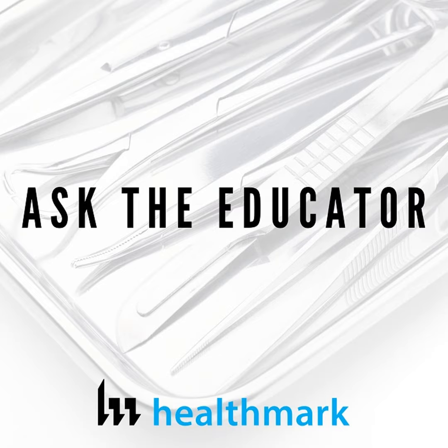So at any rate, I'm just going to add one quick thing too, because I think this is an important note. When you look at SPD and production, there's not one manufacturing plant in the world that allows one person to produce the product and not have somebody else check it before they put it on the shelf to sell, right? And that's something that needs to be built into every SPD.